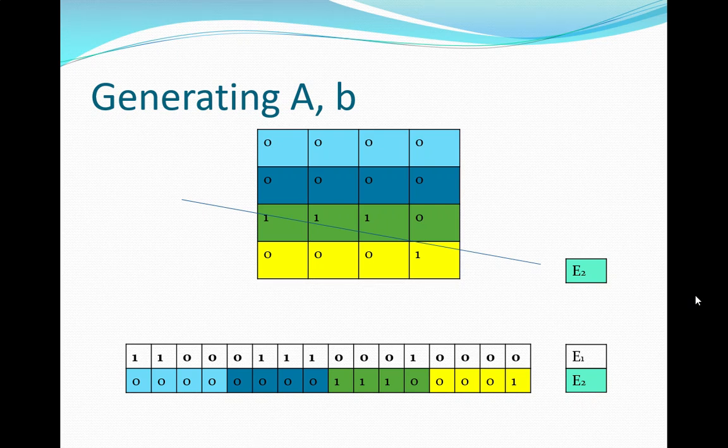So you have to account for those when it's in it, but you'll just pick up, just like this is one slice, you'll then pick up the next slice. So when you're doing multi-slice, it just goes slice one, first section, next section, slice two, next section, slice three, and so on and so forth. And same thing, proportion on X.